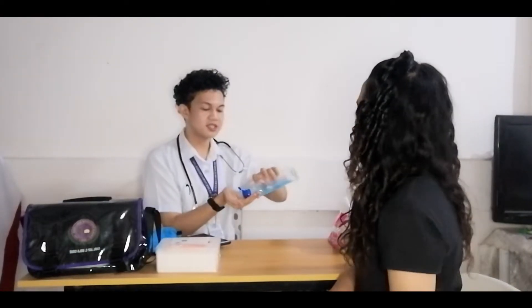So now let's greet our patient and take their vital signs. Good day, my name is Carl J. De La Cruz, I am a student nurse. Just for verification, may I ask your full name? I am Cindy De La Cruz.